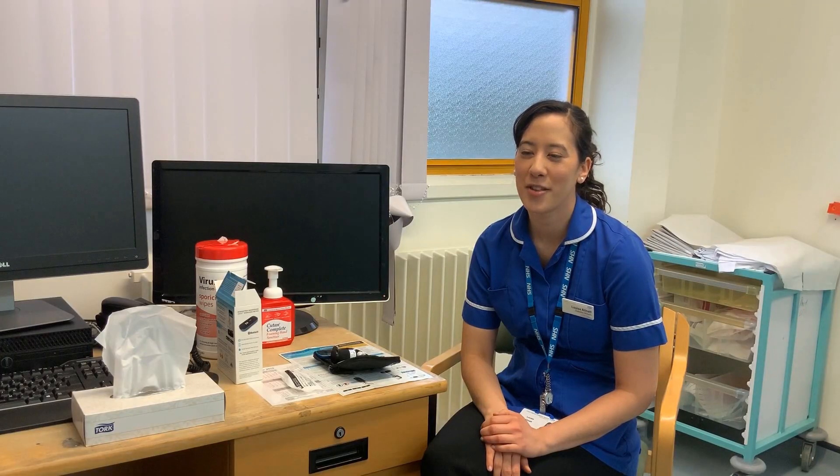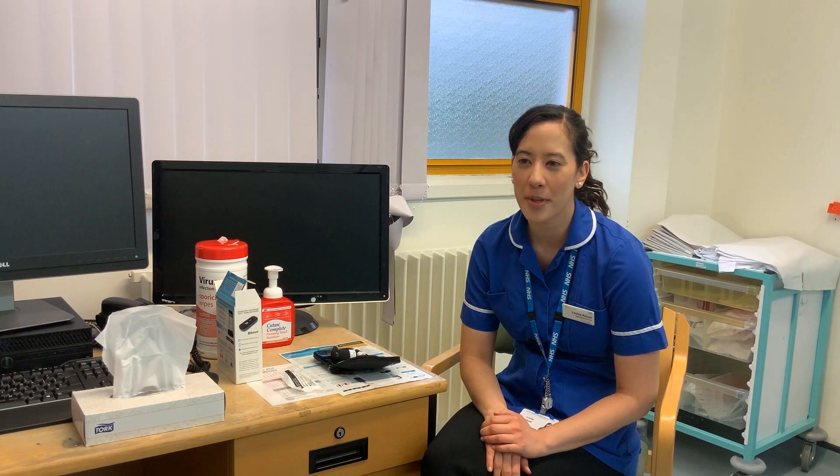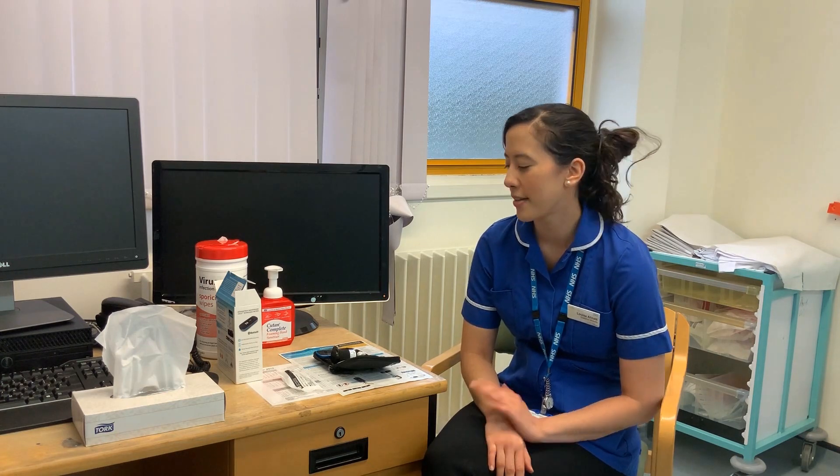Hi, my name is Louise. I'm one of the Diabetes Midwives based in the Antenatal Clinic in Milton Keynes. If you have been diagnosed with gestational diabetes, we will ask you to monitor your blood glucose levels four times a day until the birth of your baby, and today I'm going to demonstrate to you how you would do that.